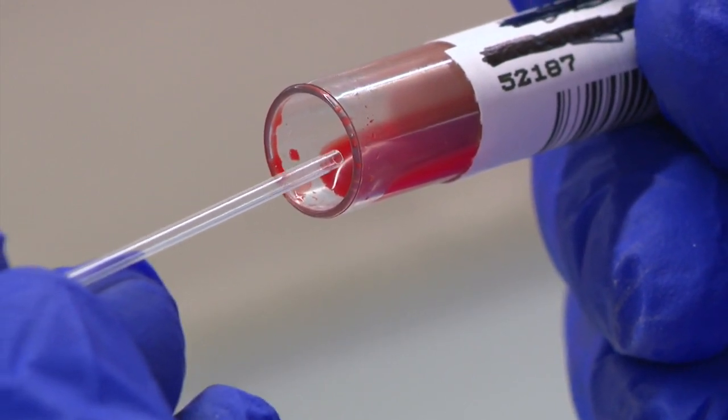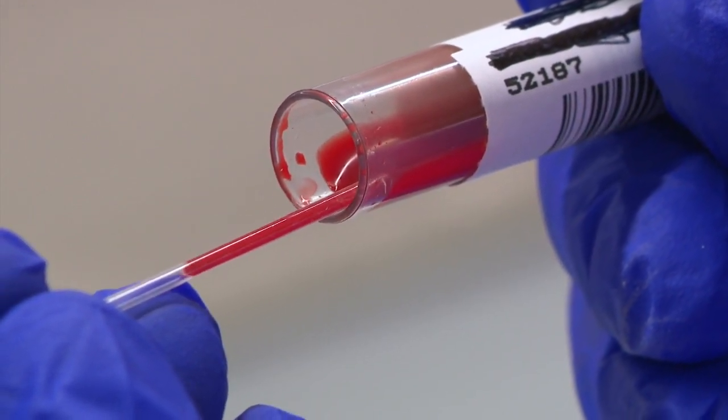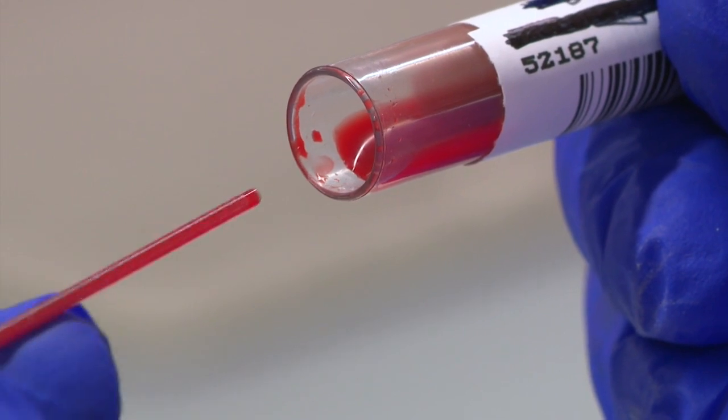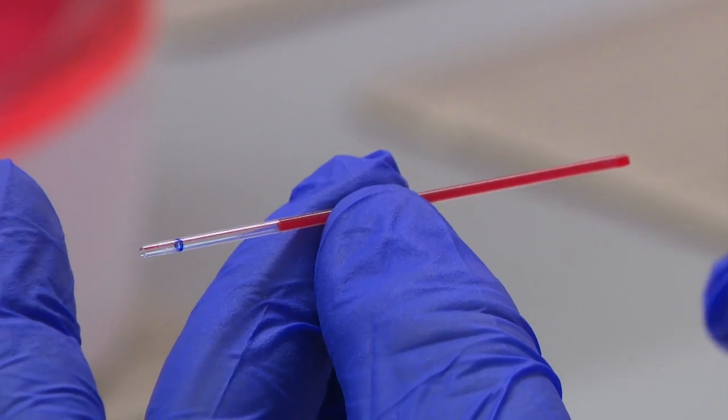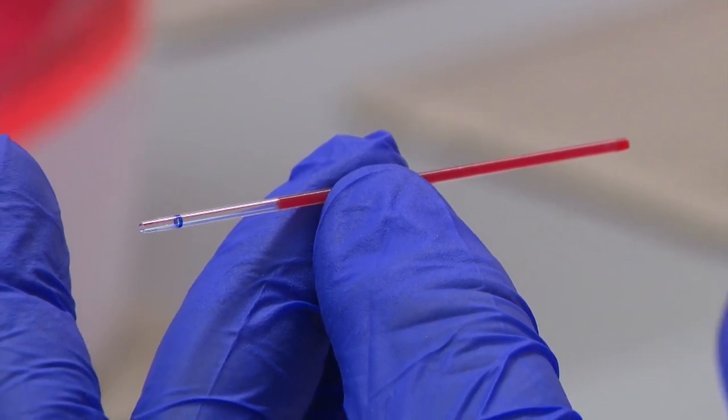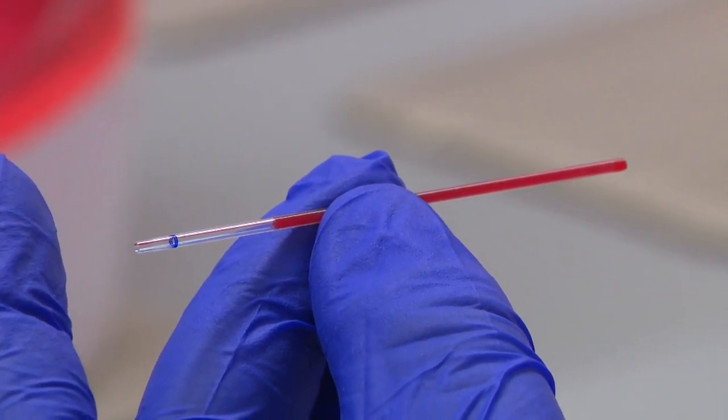Carefully tilt the EDTA sample so that the blood moves closer to the open end of the tube. Place one end of the micro hematocrit tube in the blood and then tilt the micro hematocrit tube down. It will fill with capillary action. Place your finger on the opposite end of the capillary tube and hold it there to stop the blood at the correct height.